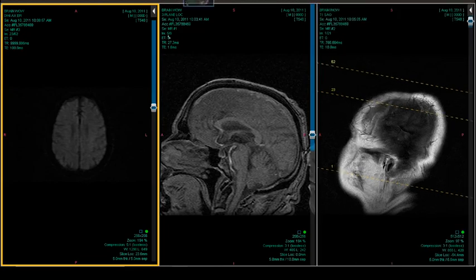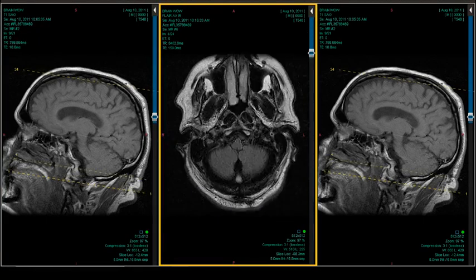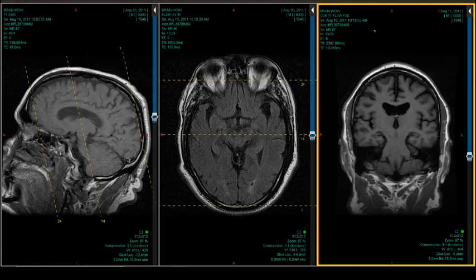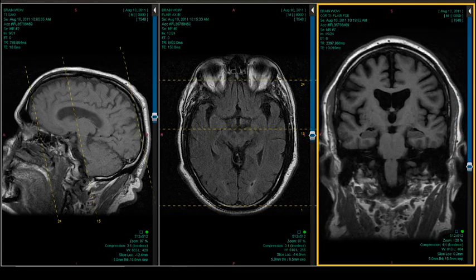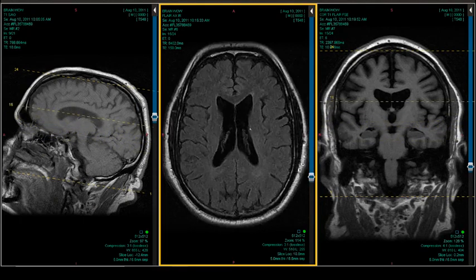You can pull down your official sagittal. These are just scouts. I like to pull up a FLAIR, and another projection, maybe a coronal. My coronal is a T1. These are 5 millimeter 2D cuts. It's actually a T1 FLAIR. So I've got a T1 FLAIR. I'm going to blow that up while you guys are getting oriented, and I'm going to blow up my standard water suppression FLAIR, my so-called T2 FLAIR.